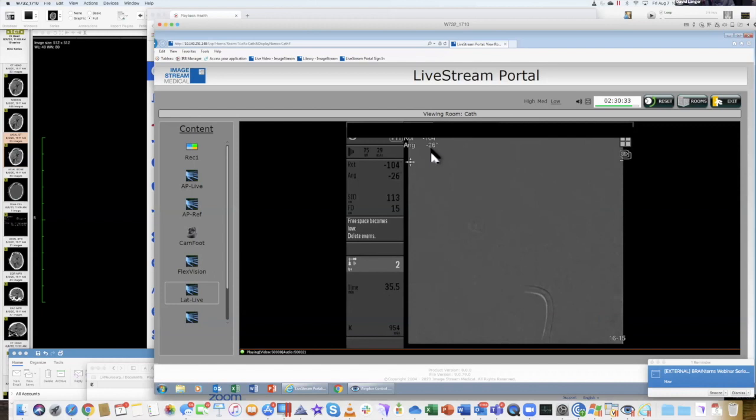Dr. Lango, hit it in the middle of the coil. Yeah, I'm watching. I just had a question about the right anterior cerebral. That's all. Okay, I'll put you on. Wait, I'll wait.